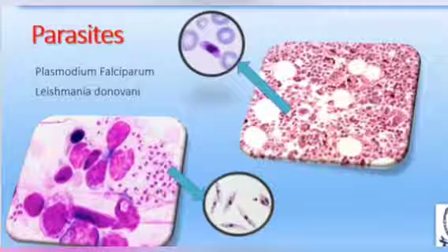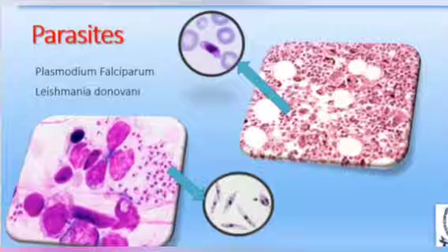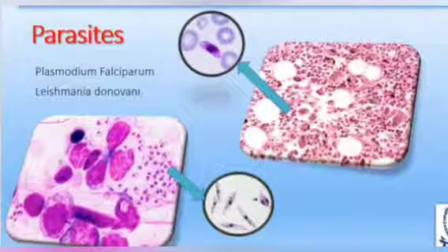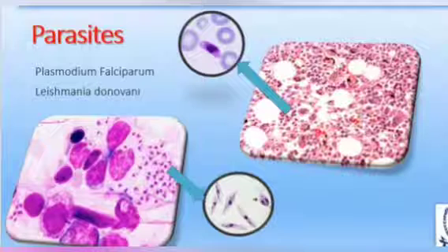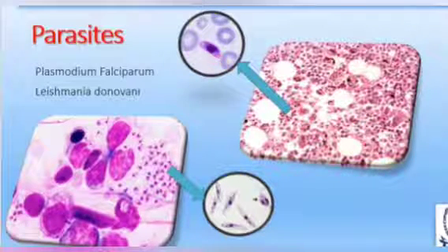You are also examining for the presence of parasites, particularly Plasmodium falciparum. This is a bone marrow smear, and here you are looking at the zoomed view.